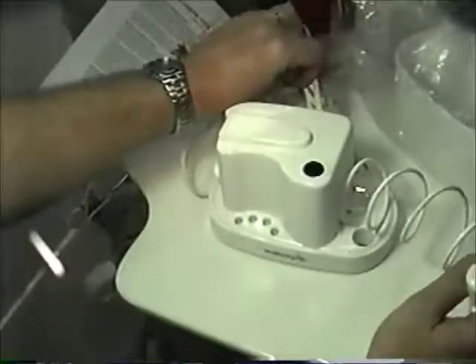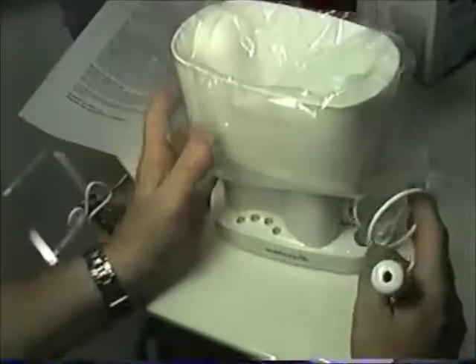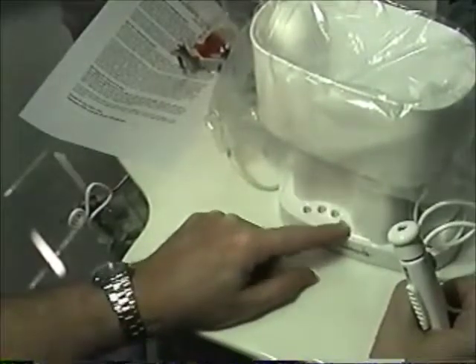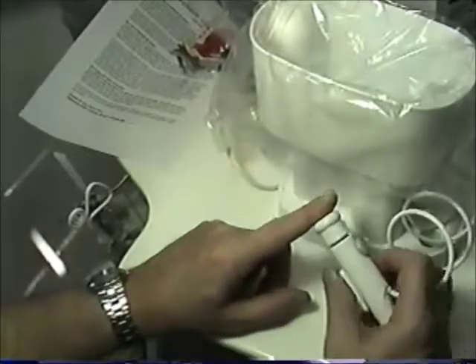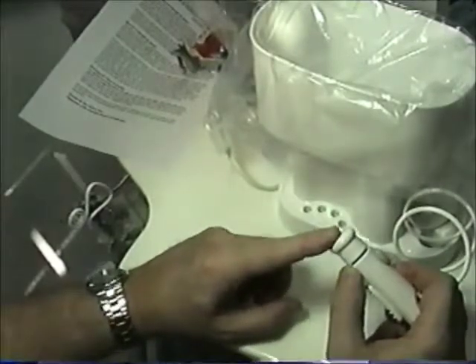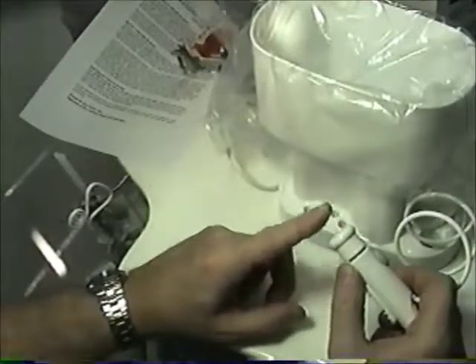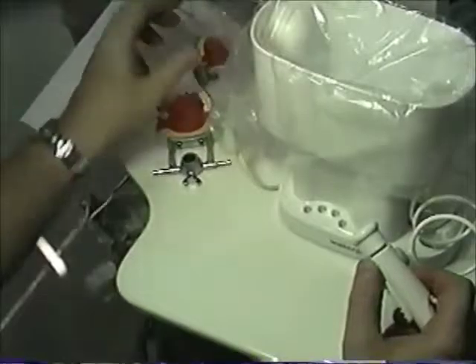One of the things you'll see later is that you get used to this unit, but I tell you, when you use this over the sink, there's so much water coming out of it. You can buy multiple tips for this, and these are the tip holders. Basically, you don't want to be using the water pick and spraying it inside your mouth, because your mouth gets filled up with water very, very fast.